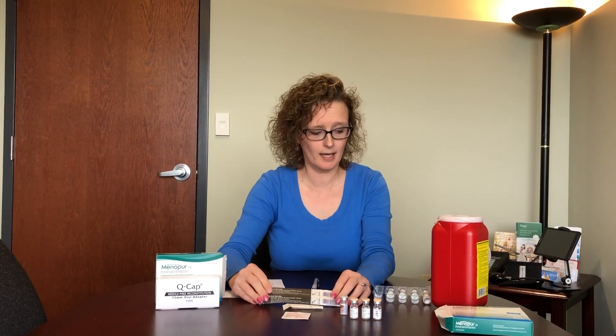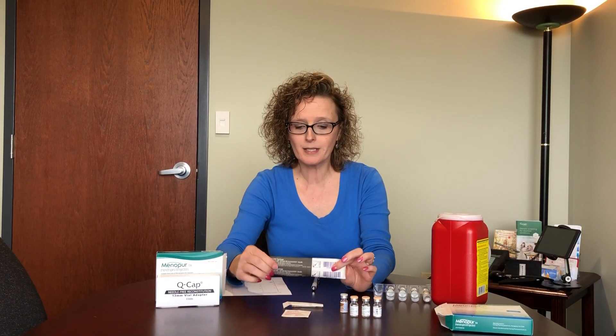To mix the medication, start by washing your hands. Make sure you have a nice clean environment with everything set out. I recommend laying everything out each day when you get ready to do your injections. These cannot be mixed ahead of time — we don't want any changes in the efficacy of the medicine — so it's best to wait until just before the injection to mix.